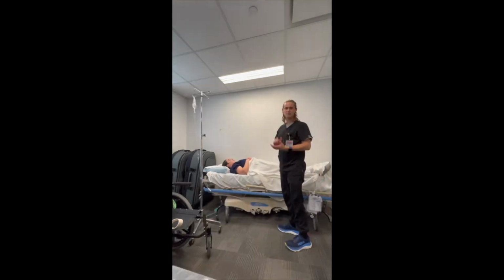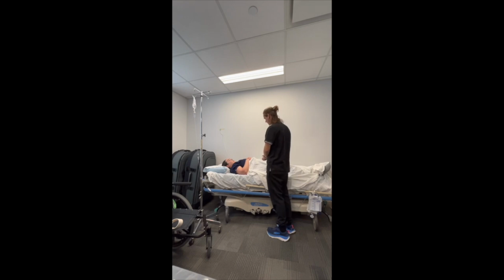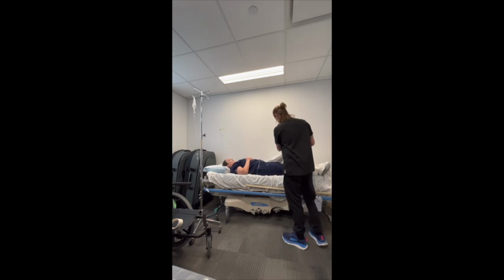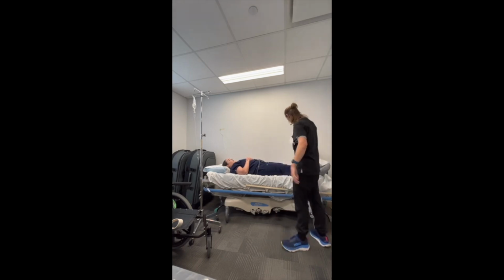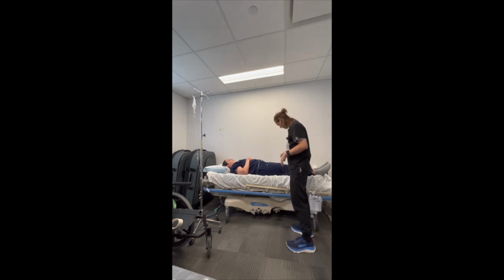Okay, so now we're going to perform our supine to sit transfer. So, hey Mackenzie, are you ready to try and sit up at the edge of bed? Sure. Okay, is it okay if I remove your blanket? Yeah. Alright, so this is really important because we want to make sure that we're visualizing all of the lines and tubes before mobilizing.